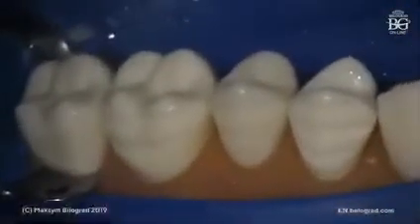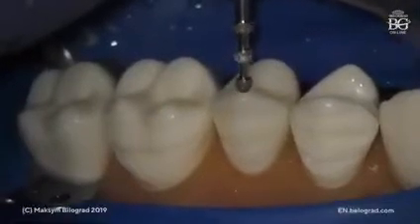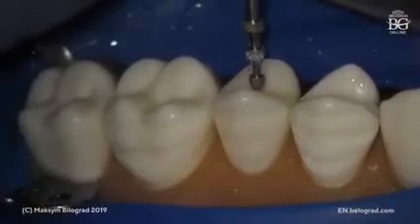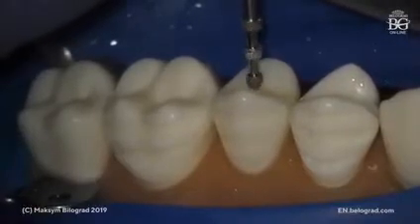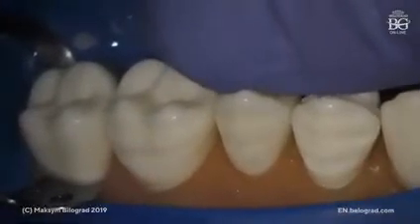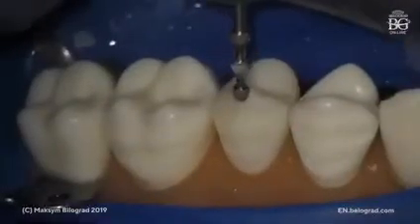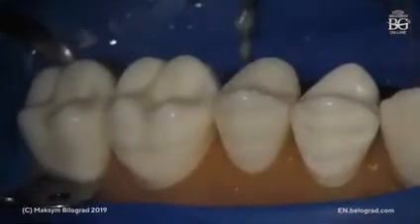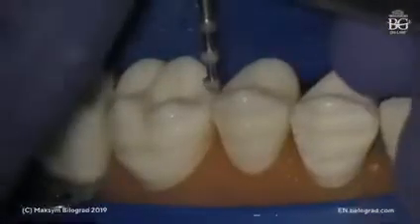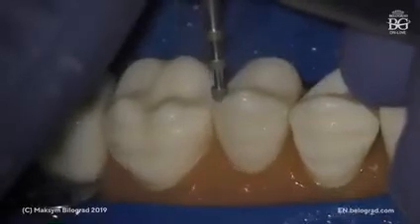So the same will be done here, and it is really important for you to keep your burr straight over the tip of the cusp in order not to get your burr in occlusal surface. Don't go here. Imagine that this premolar is canine. Okay, I will close a palatal cusp. So this is our canine, and we will prep just over tip of the cusp without inserting our burr to the occlusal surface. Okay, so this will be done in specific way.